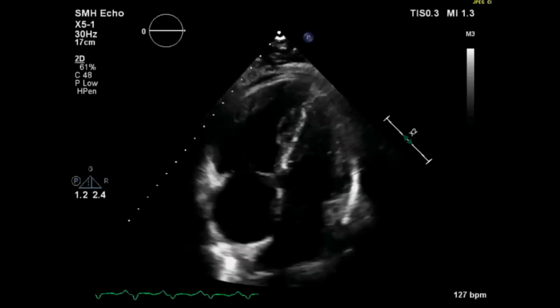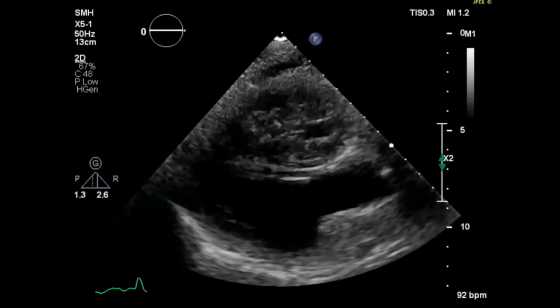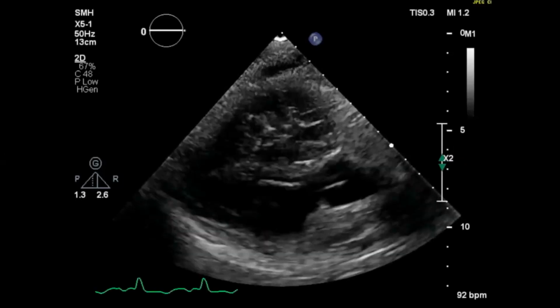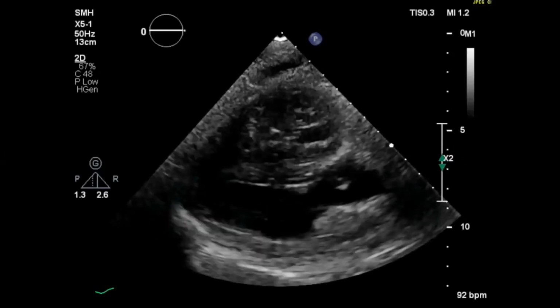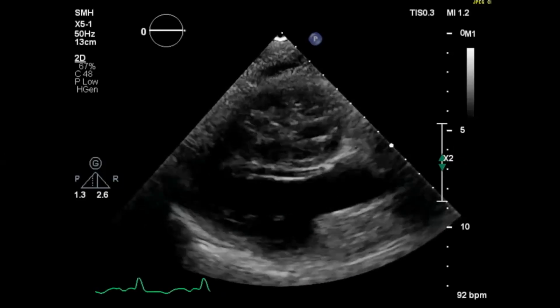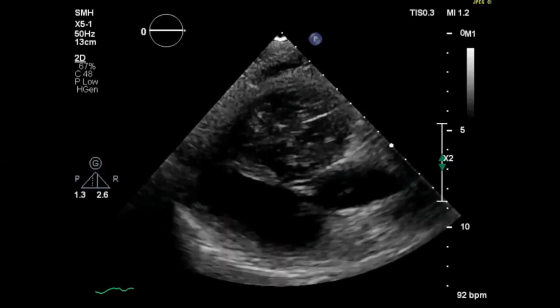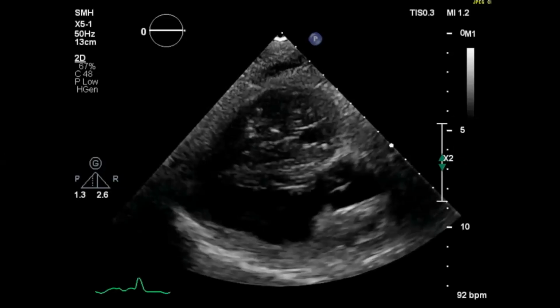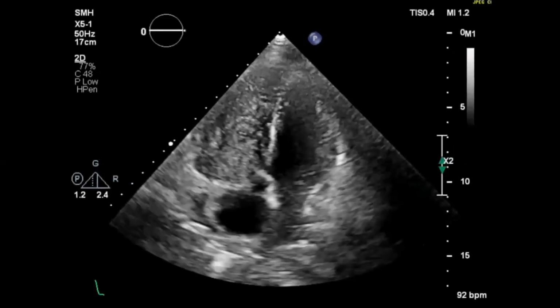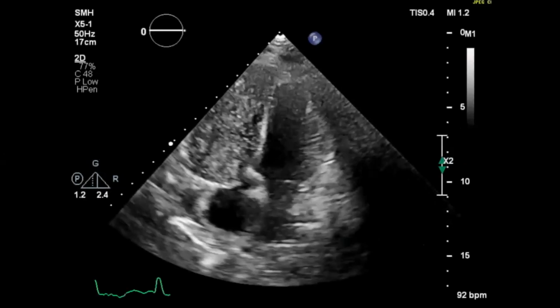Thank you. I think we have a little bit more time. I'll just show the third case. This was kind of that initial screening in the parasternal long axis essentially. Any thoughts? Yeah, hypertrophy, it looks like there's something in the RV. Maybe. I'll show you a different view. Okay. So a mass in the RV.